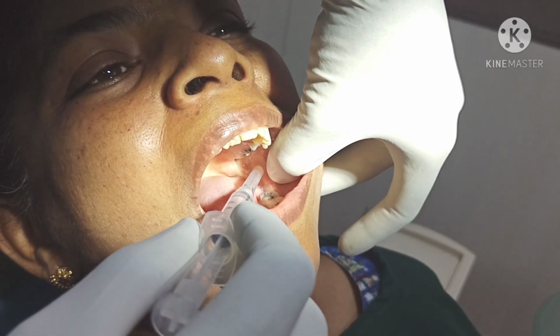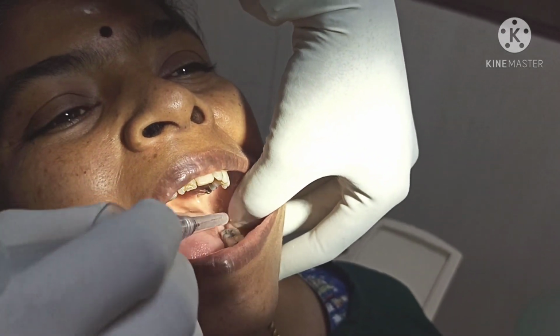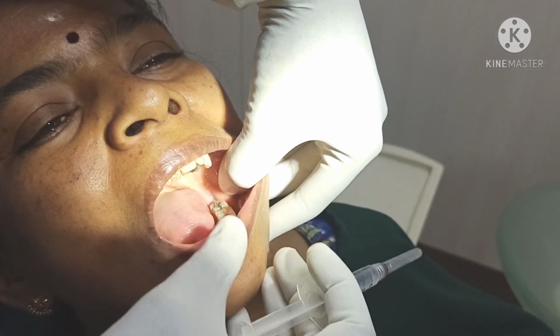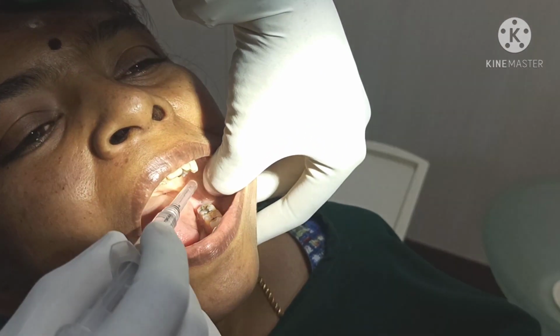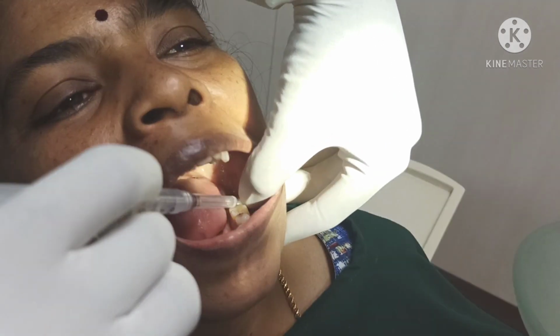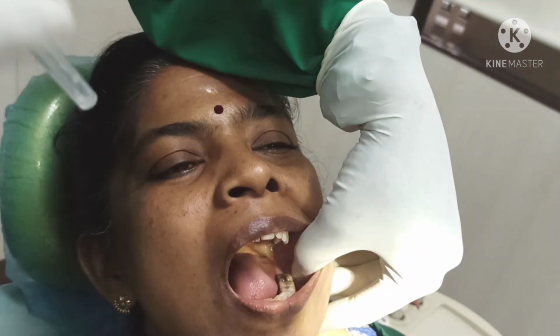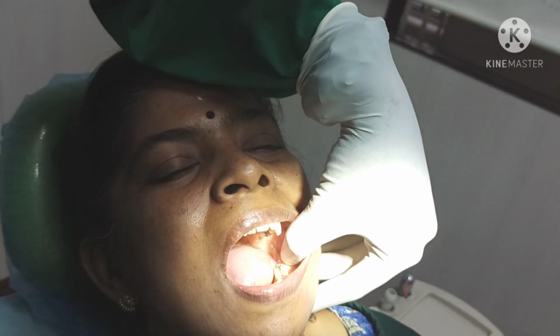Now after giving the inferior nerve block, commonly we give the long buccal nerve block, or long buccal infiltration, whatever it is. It is not needed in all situations. If you are planning for any root canal, there is no need for a long buccal nerve block. Only if you are planning for extraction of 6, 7 or 8, or doing some flap elevation in the 6, 7, 8 region, then long buccal is needed.